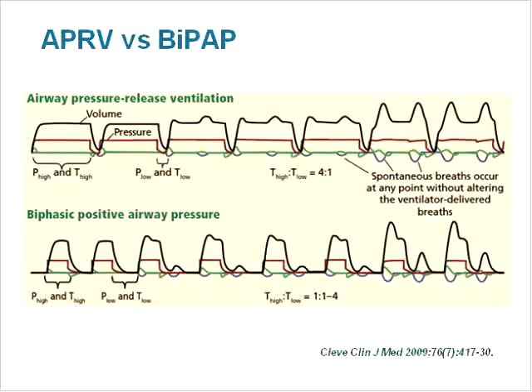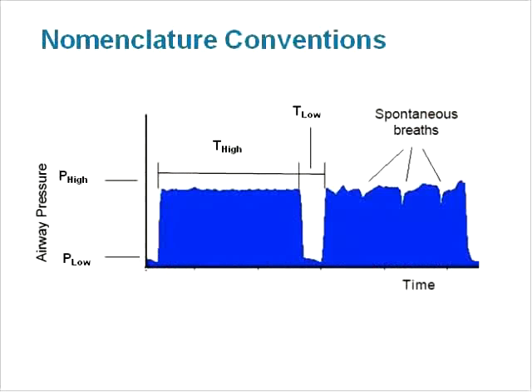Finally, do not confuse BiPAP, as we are describing here, with the so-called BiPAP mode popularized by Respironics home care ventilators, for which pressure-targeted breaths are flow-cycled instead of time-cycled. At this point, we should review some conventions regarding the terminology of BiLevel ventilation.